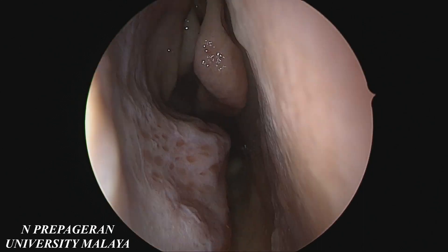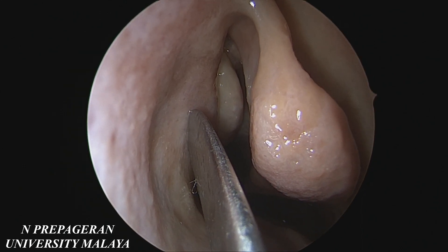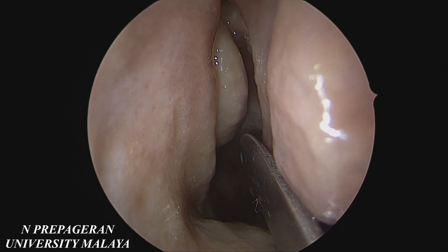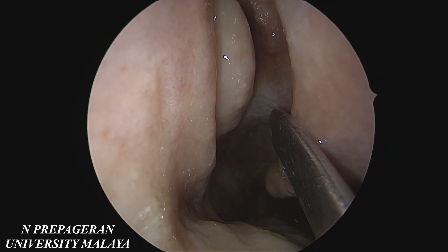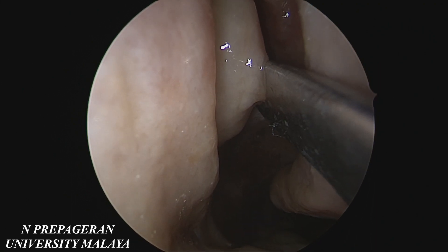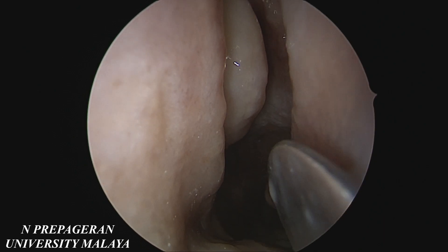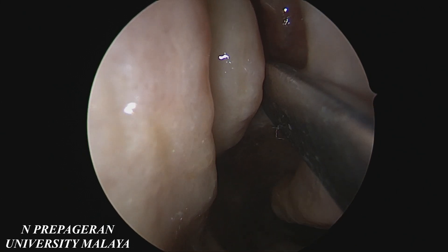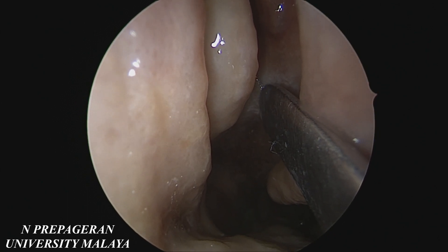Now let's look at the gates. Gate 1 is the uncinate process. Gate 2 is the bulla. The bulla is like a prosperous stomach — as you grow older, this is how your stomach will become as well. Gate number 3 is the ground lamella where the middle turbinate turns laterally to go to the medial wall of the orbit. Uncinate gate 1, bulla gate 2, ground lamella gate 3, and behind that will be gate number 4 which is the anterior wall of the sphenoid sinus.